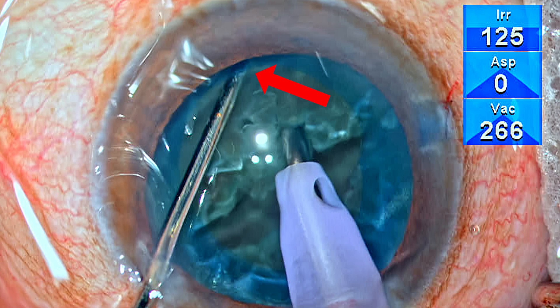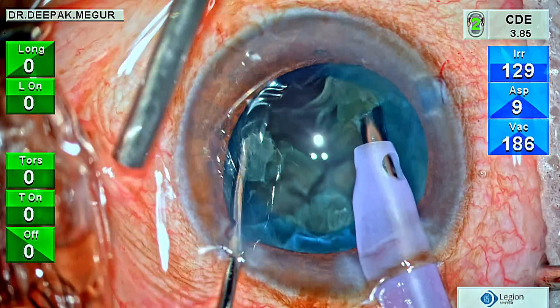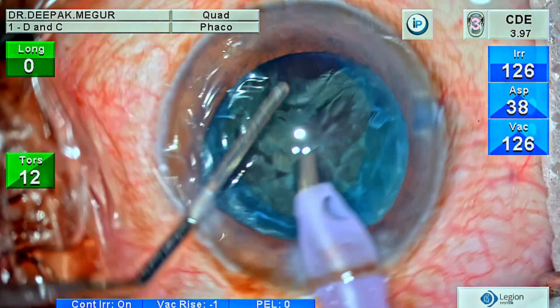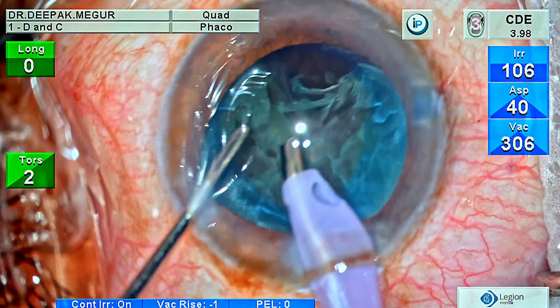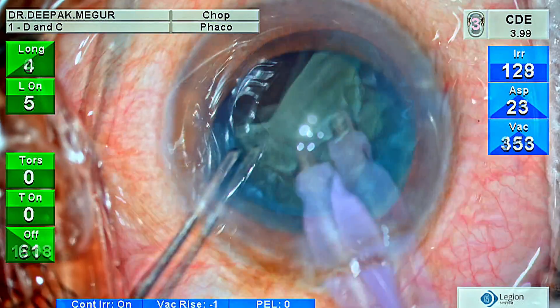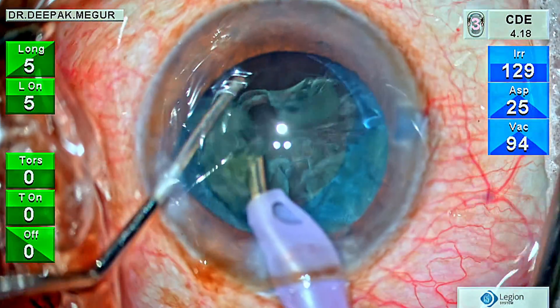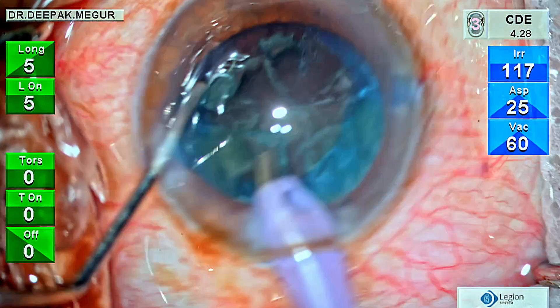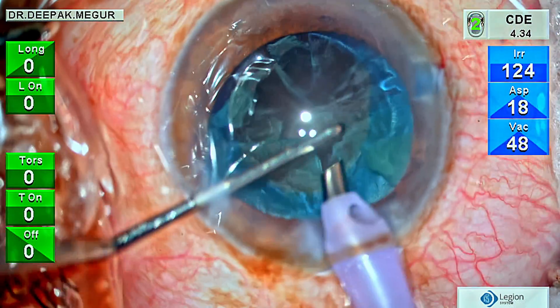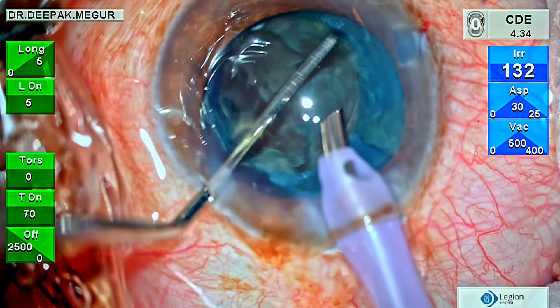Being an extremely soft cataract, it gives me only a partial chop — the nucleus is separated peripherally but the central sticky posterior plate still stays in. Since the superficial part is broken, I can hold and grab each fragment, flip it out of the bag and remove it. The posterior plate remains inside the bag, but this debulks the nucleus. Once debulked, there's enough space to maneuver, and management of the second heminucleus becomes extremely easy.